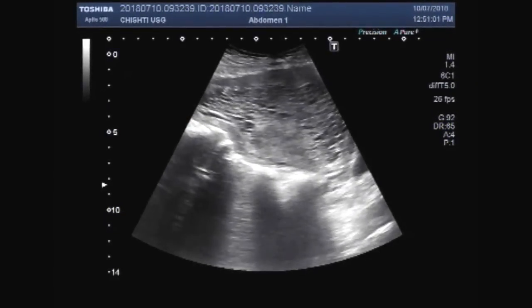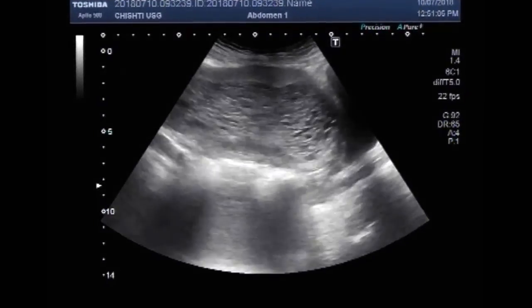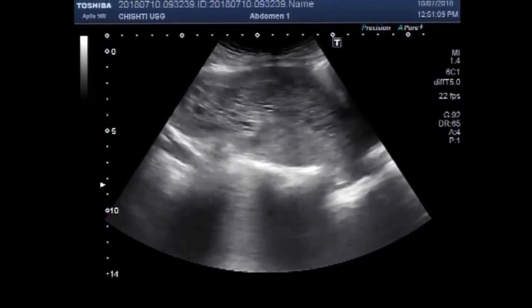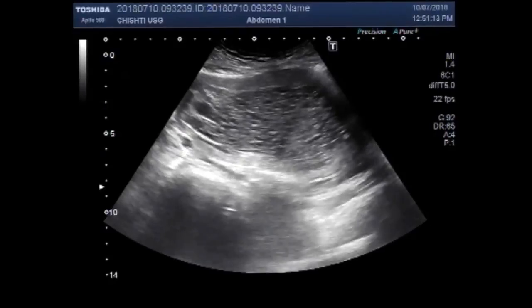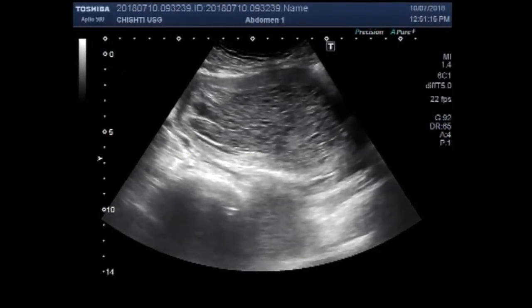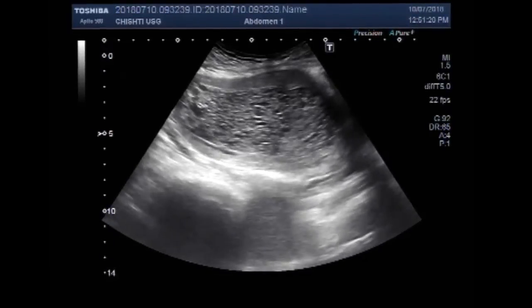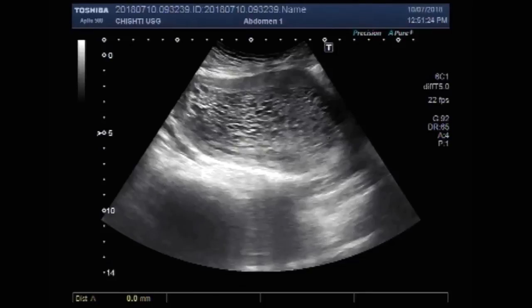Again you can see the uterus having a large Molar Pregnancy. This is the measurement of the Molar Pregnancy.